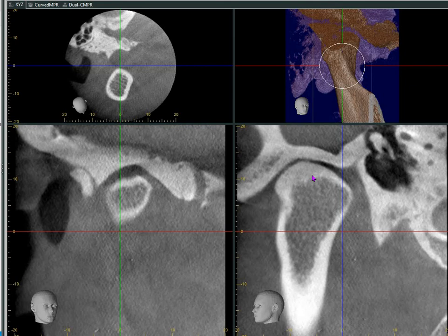Now we also get a lot of inquiries from patients who have had CT or MRI studies, which have concluded that their joints are normal, and none of their doctors suspected that they have a TMJ problem because there are no joint noises or pain. As you've seen in the CT scan, that is the reason why this happens.